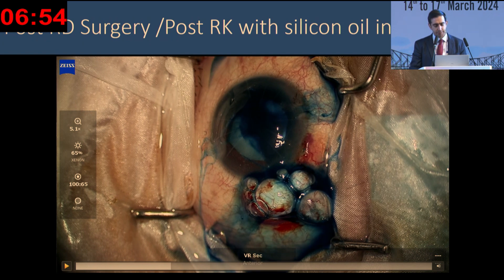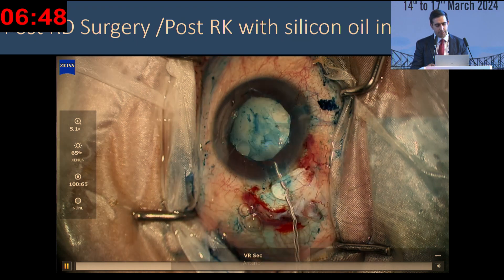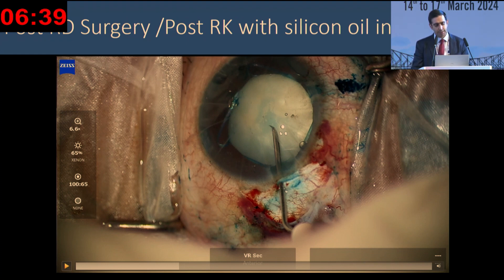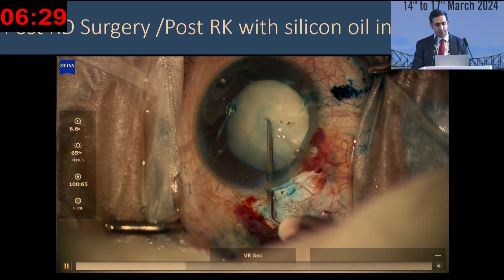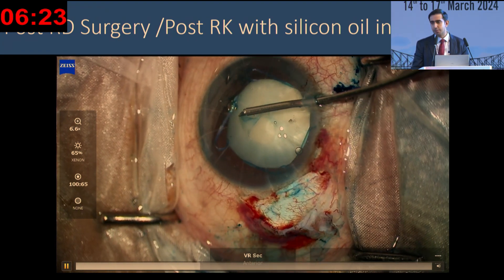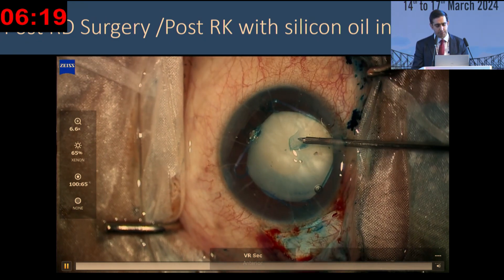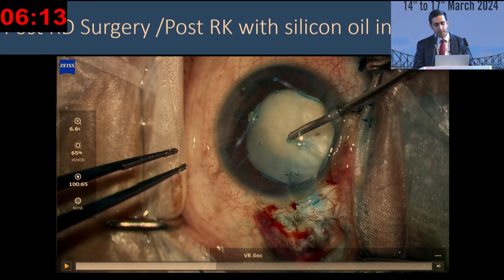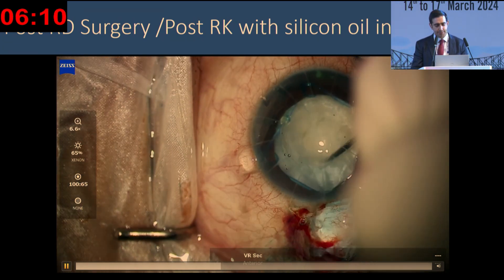I first used the bimanual to wash out the viscoelastic and tried to repeat the staining to get a better view of the capsule. Then Healon was instilled because this is an intumescent type of cataract, so we wanted to push the capsule back. My technique in intumescent cataracts is I use a needle cystitome with a 2cc syringe, go inside, and then aspirate a little fluid out to bring down the intrabag pressure. Then we use the 23-gauge micro-rhexis forcep to fashion a rhexis. The visualization was not very good, so I ended up making a slightly smaller rhexis in this particular patient.